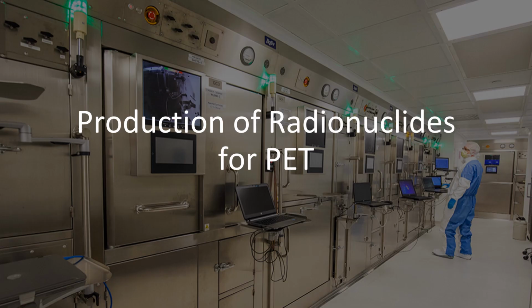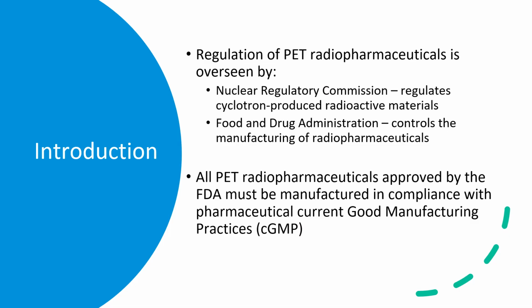Now we're going to talk a little bit about the production of radionuclides for PET. So regulation of PET radiopharmaceuticals is overseen by a couple different institutions. The Nuclear Regulatory Commission regulates cyclotron-produced radionuclides, and the FDA also oversees the production and manufacturing of radiopharmaceuticals.